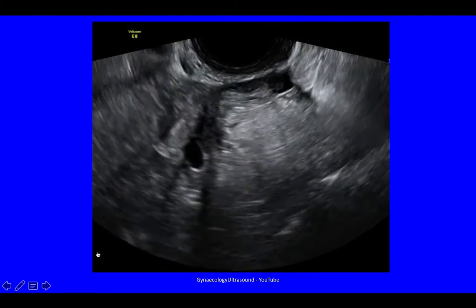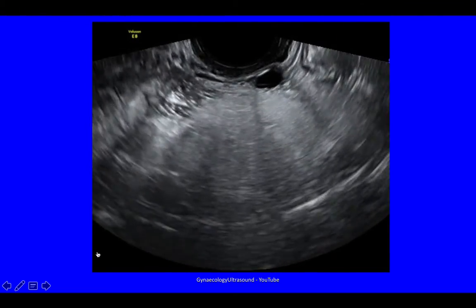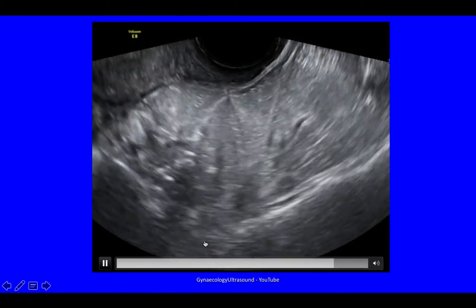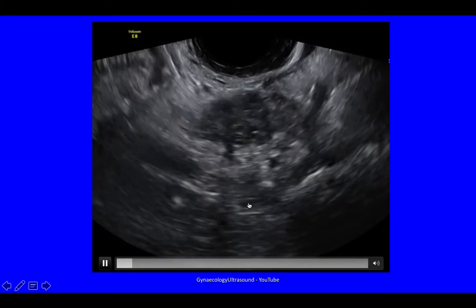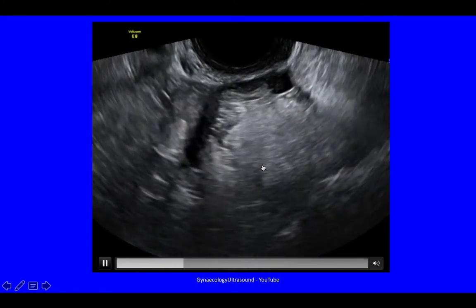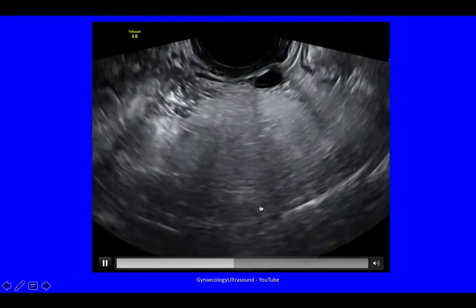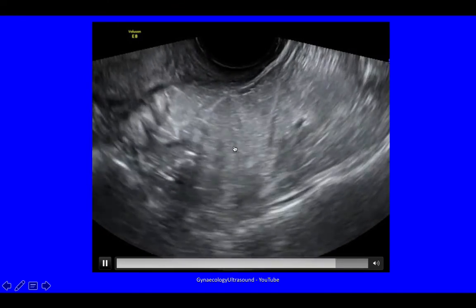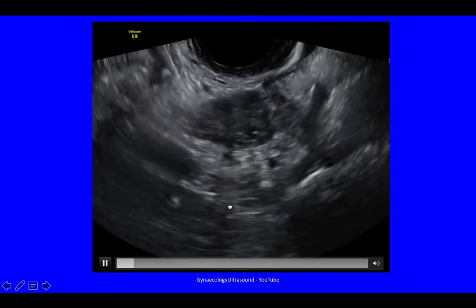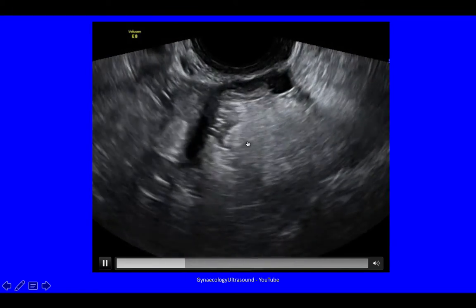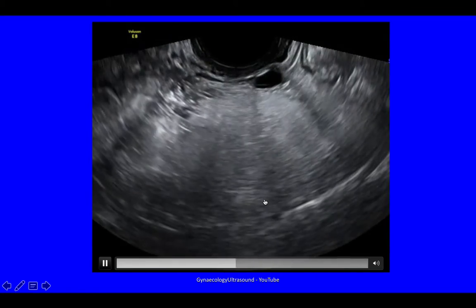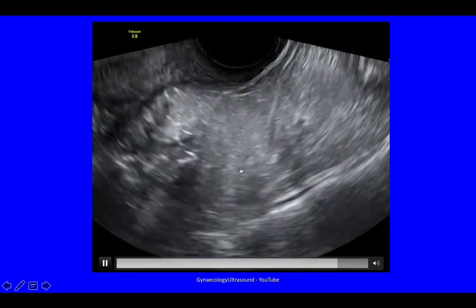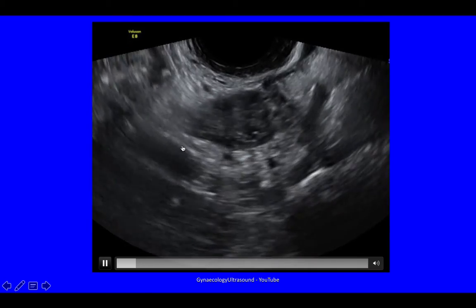Looking at that video image again: when it starts, you can see a little bit of normal ovary. This is the cyst, which is confluent with this cyst with some mixed echogenicity contents, most obvious there. And then that's the other ovary — the normal ovary. This is the cyst with mixed contents, very obvious here, with some lines there, and then going into the other ovary.